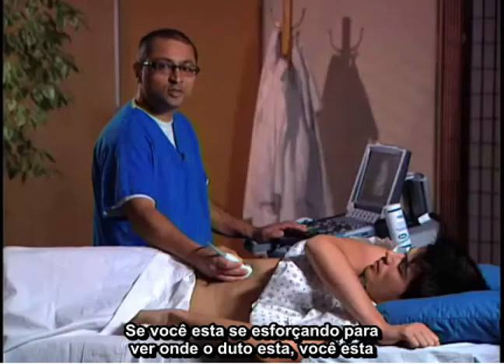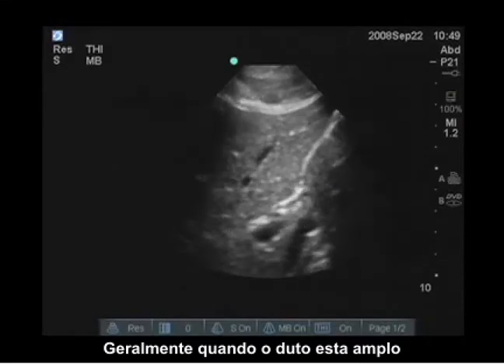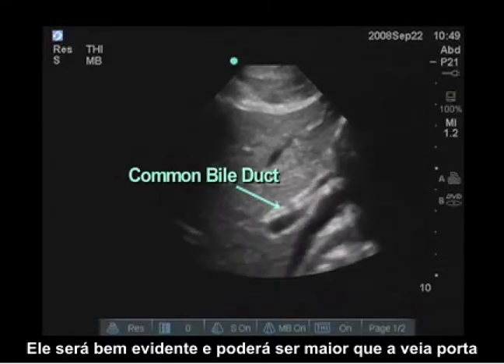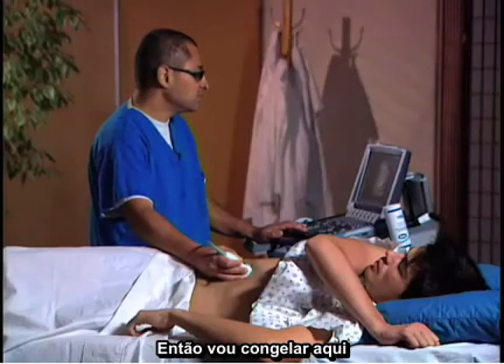If you're squinting at the screen like I am trying to see where the duct is, you're dealing with a patient with a normal duct. Usually when the duct is enlarged, it'll be quite evident, and can be as large as the portal vein itself. So I'm going to freeze this here.